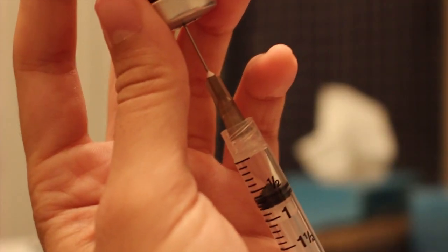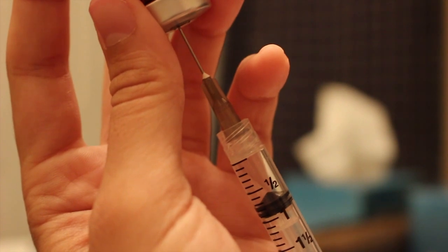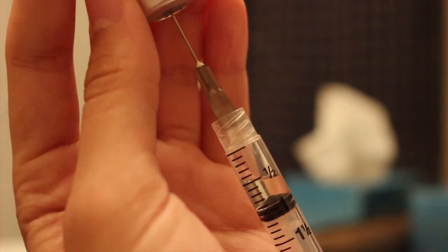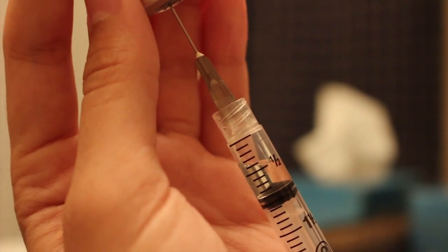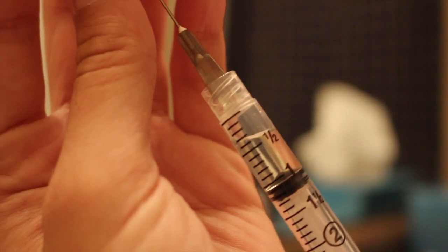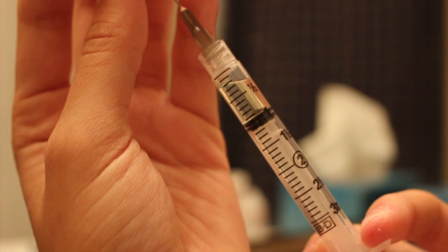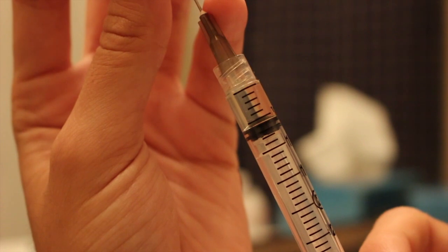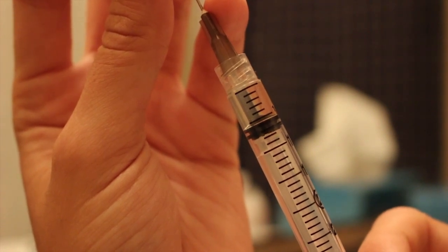Then I flip the vial over so that the testosterone comes out a little bit more easily and I start pulling on the plunger. You should get the testosterone coming out. What I do is I always get more testosterone than I actually need so that I can push it back into the vial to get the correct amount. That little black bump — the top of that black bump is where you're going to stop when you have the amount that you need. I stop at the four before the half mark.